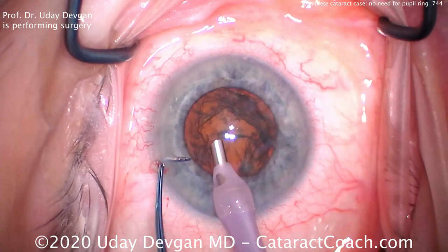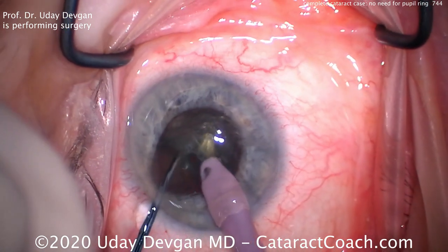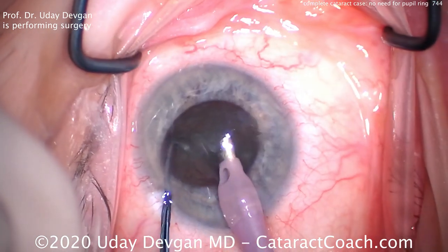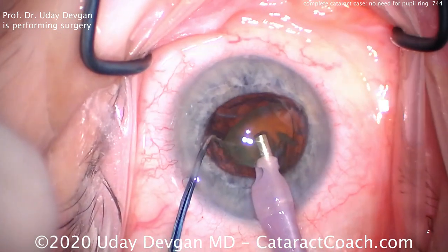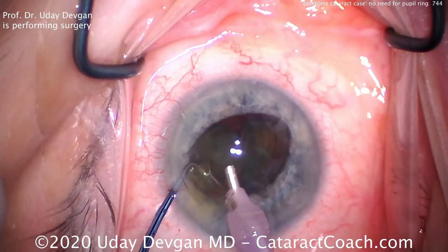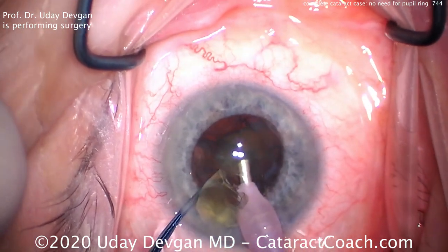Getting our phaco probe, we're gonna use high vacuum — about 400 to 500 millimeters of mercury — high flow, 40 cc's a minute. Buzzing the phaco probe to hold the nucleus. The chopper goes in and we can split this nucleus right there in the capsular bag. Now we take our time to really make sure we split the two halves. Then we can bring the first half up with the high vacuum level, use the chopper, and chop off small pieces. We're gonna remove one hemi-nucleus first by chopping it up into smaller pieces.